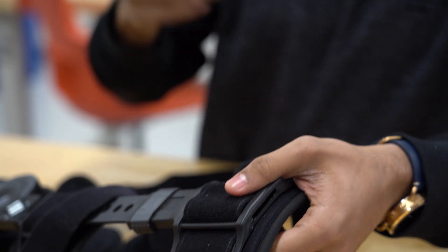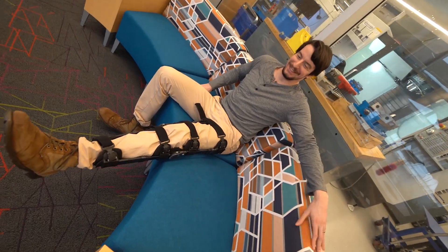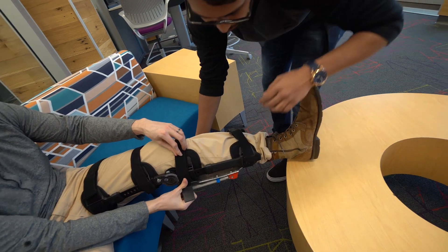One of our teammates' mom was actually in a leg brace, and he wanted to solve the issues that she went through. When people wear full leg braces, there are a lot of problems that occur. Sitting down in a chair is one of the main problems that we focus on — it's really hard to sit down with proper posture. You end up slumping over, usually needing another support chair or something else.